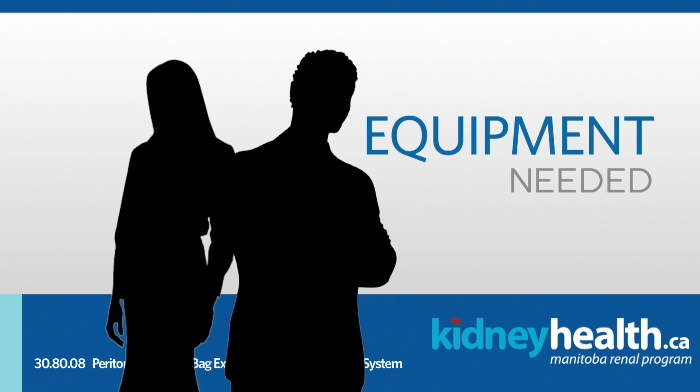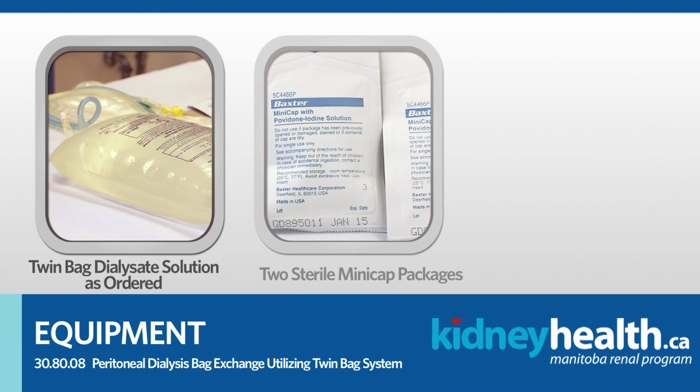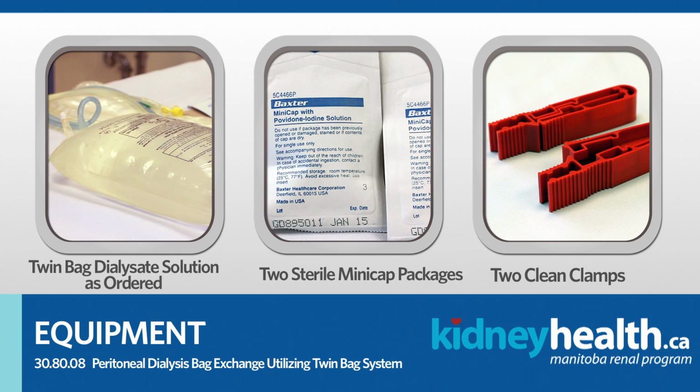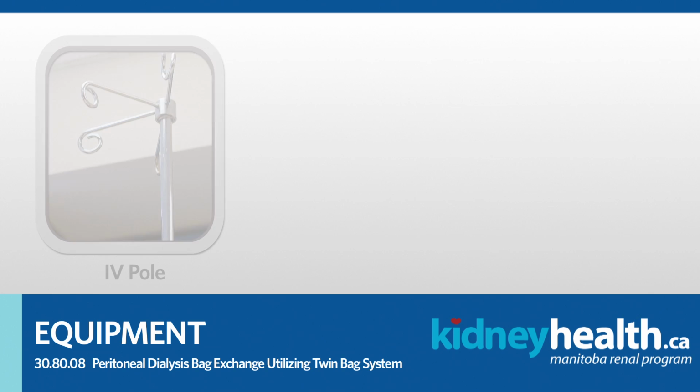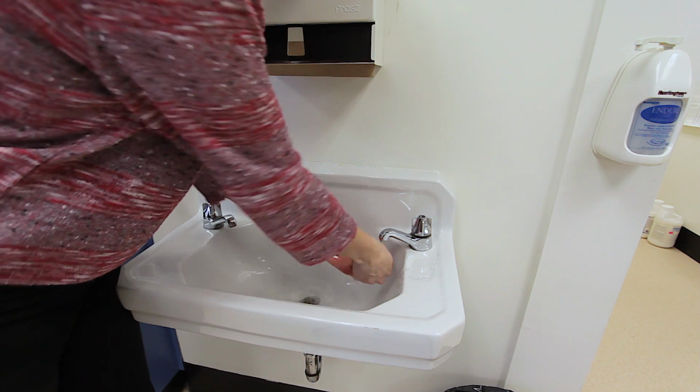The following equipment will be needed for this procedure: twin bag dialysate solution as ordered, or per Nursing Assessment Policy Statement 2. 2 sterile mini-cap packages. Check the expiry date on the package. 2 clean clamps. IV pole. Towel or incontinent pad. Clean paper towels. Perform hand hygiene.